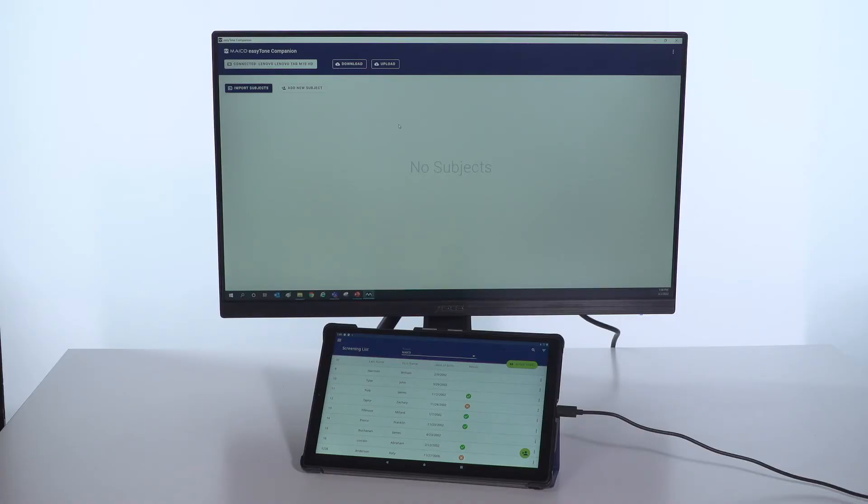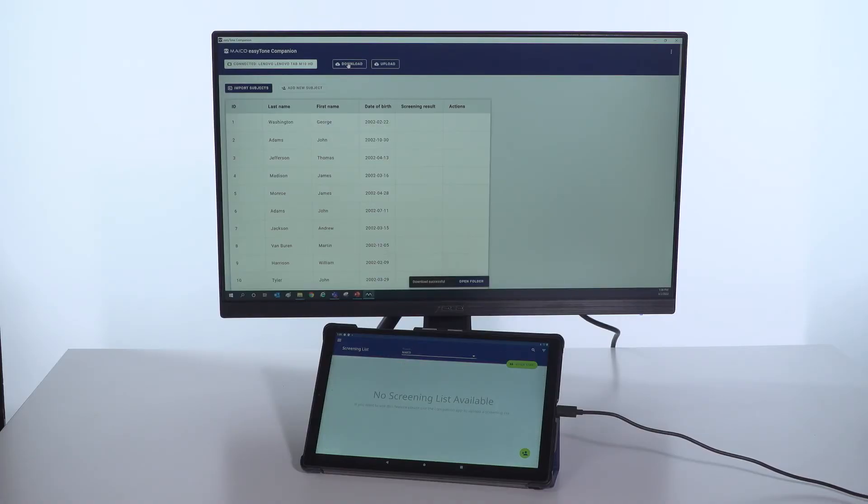When the screening is done for the day, use the Mako Companion app to export the results for easy management of mass screenings.